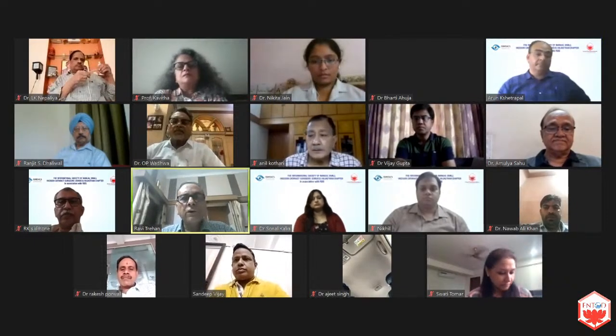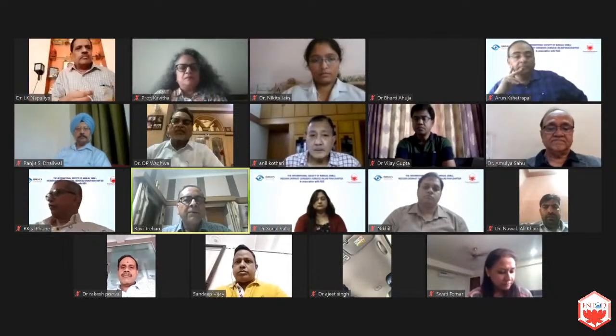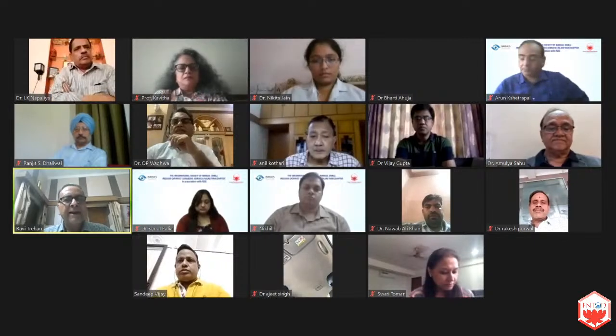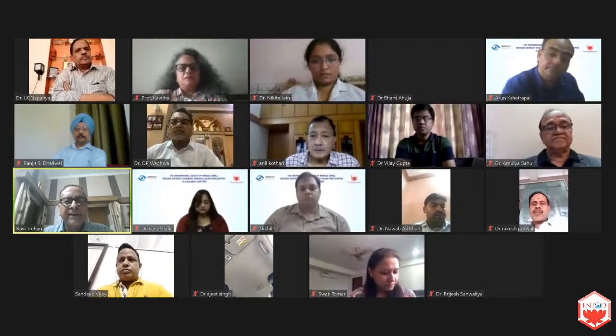Good morning all. As you know, the very first topic of today is the basics of SICS. Basics, we are dealing with only removal of cataract and putting an IOL. Of course, we have to keep in mind the corneal endothelium as well as the posterior capsule. A little overview I just want to give about SICS. Most of the time what we hear is that SICS is almost related with camp surgery. I just want to say that it is not in any way a small incision. Although Sahu sir did surgery with 2 mm, generally we are doing 3 mm, 4 mm, 5, 6, 7. So it is not small. I should differentiate between two types of SICS. One is camp SICS, and secondly, what we are doing in our practice, that is CICS, customized incision cataract surgery. This is the main difference I want to highlight.